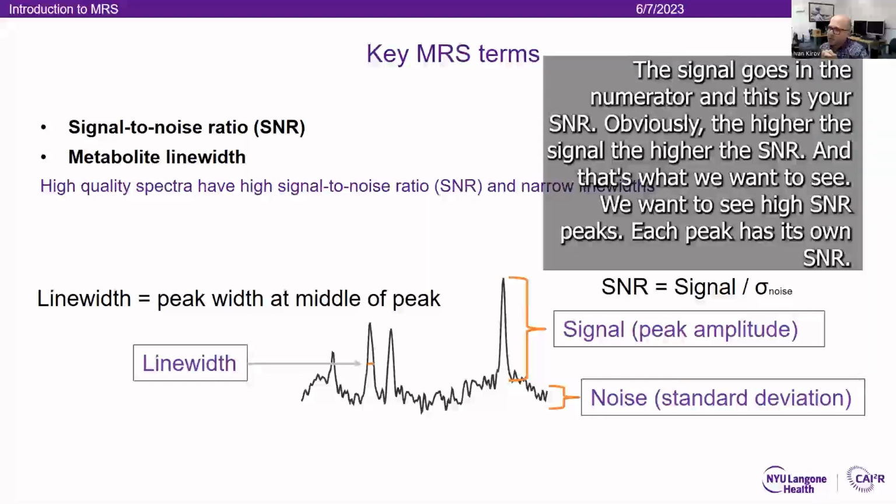Obviously, the higher the signal, the higher the SNR, and that's what we want to see. We want to see high SNR peaks. Each peak has its own SNR.